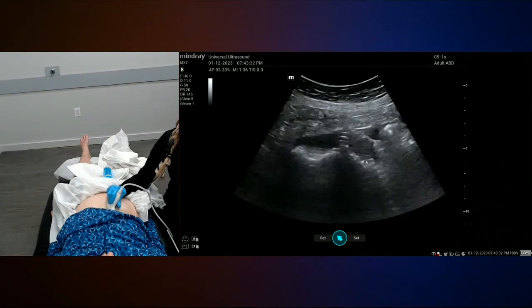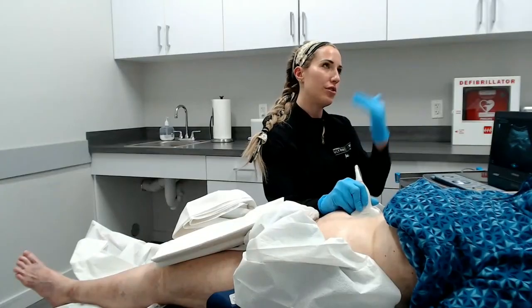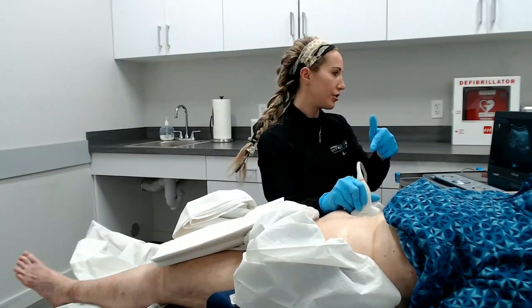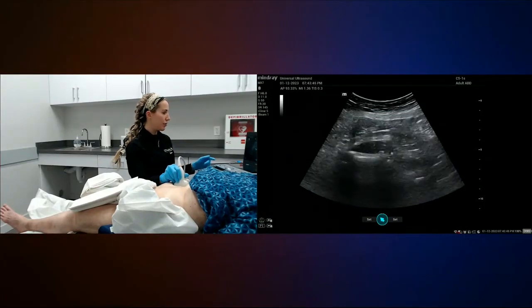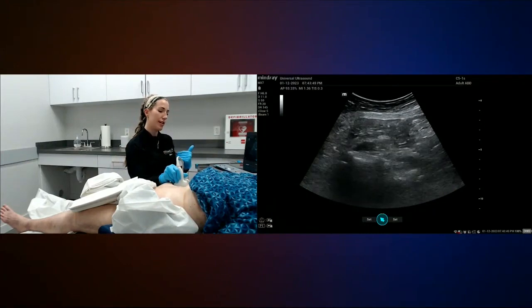And again, that's the left. So you can also get confused if you over-angulate, right? If you over-angulate, you're going to pick up the left side. So you always want to look to see where your transducer is on the patient's body, and then also maneuver your transducer as far as the anatomy is concerned. And remember, the IVC is always to the right of the spine.